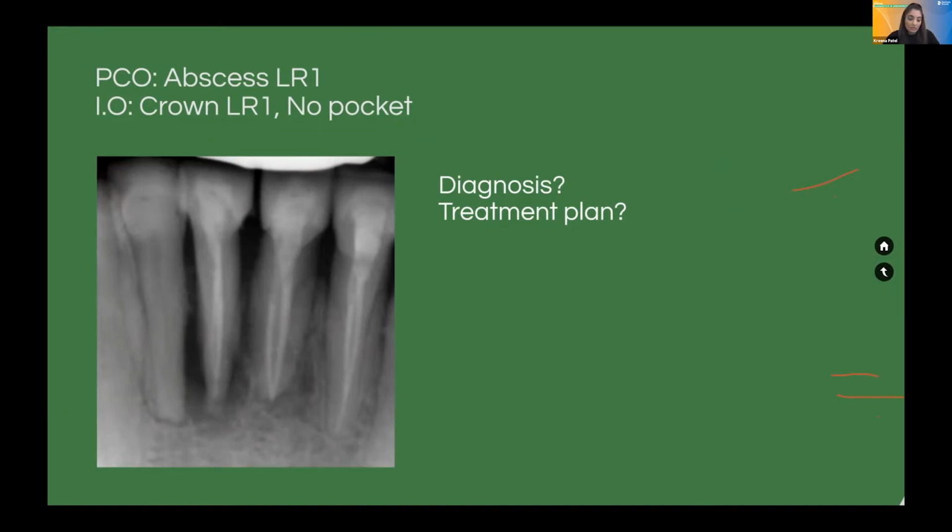There's no real obvious reason why the root canal has failed. Both the canals have been found. You can see here there's a buccal canal and a lingual canal that's been prepared. I couldn't see a pocket, so I wasn't really thinking about a fracture at this point. I thought maybe this tooth has a cyst and I'm going to need to do some apical surgery. So that was my initial outset.